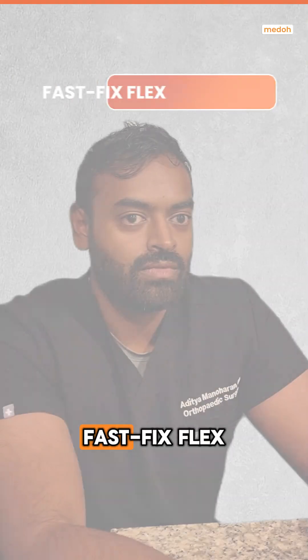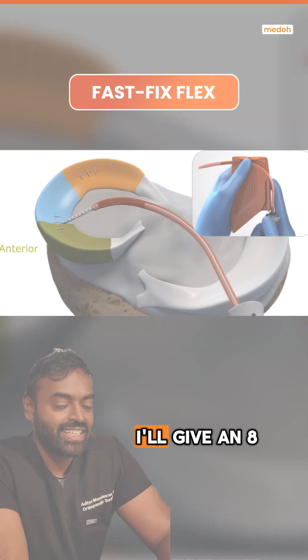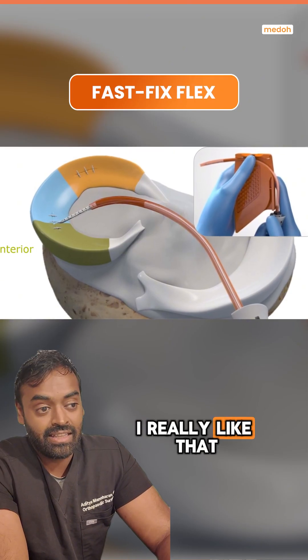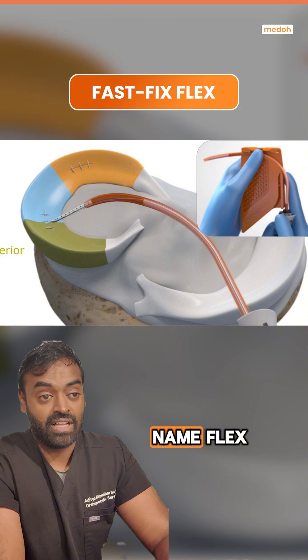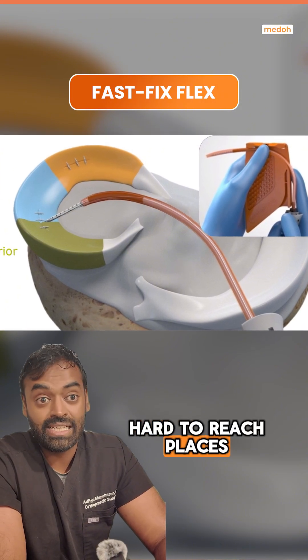Rate these miniscule repair devices. Fast Fix Flex — I'll give an 8 out of 10. I really like that you're able to bend the device. It really fits the name Flex and can help you reach a lot of hard-to-reach places.